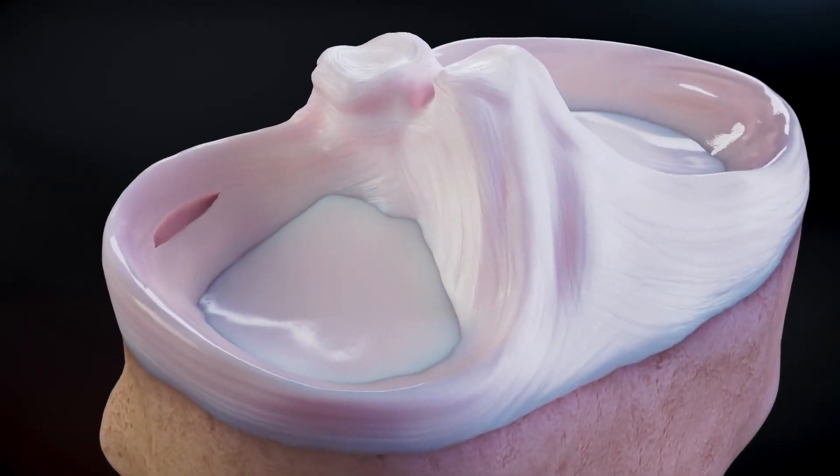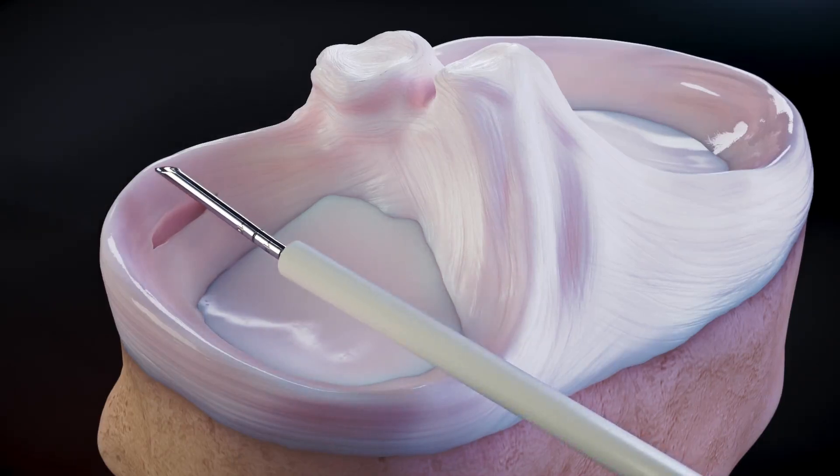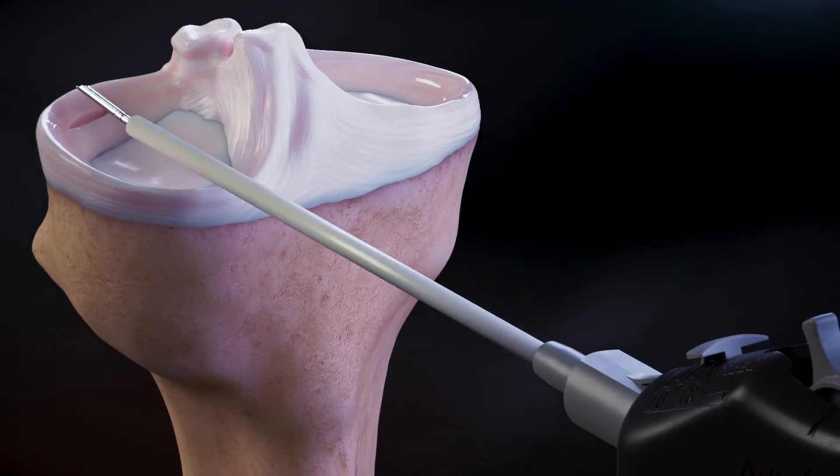Fiber stitch all inside meniscus repair. Determine the depth of penetration using the laser lines on the tip of the fiber stitch and set the depth stop accordingly by depressing and advancing the tab to the desired setting.